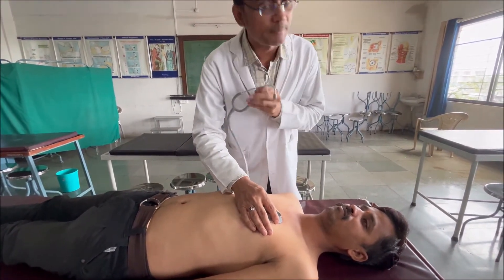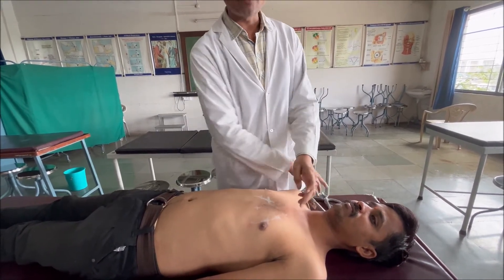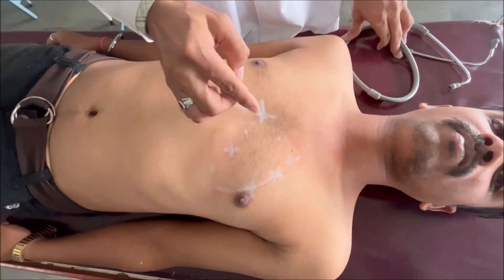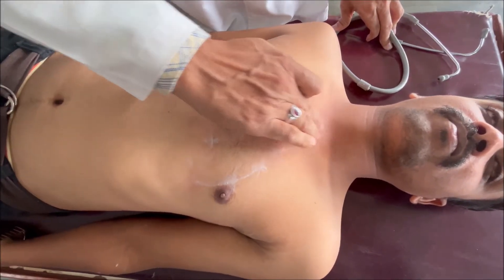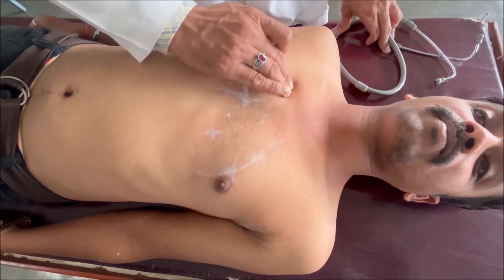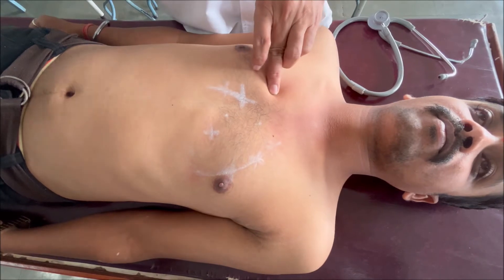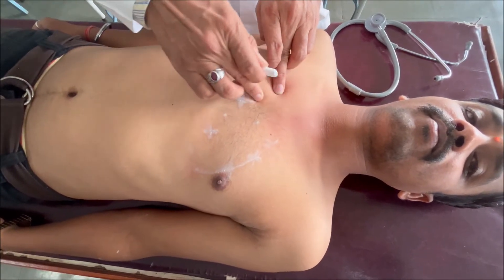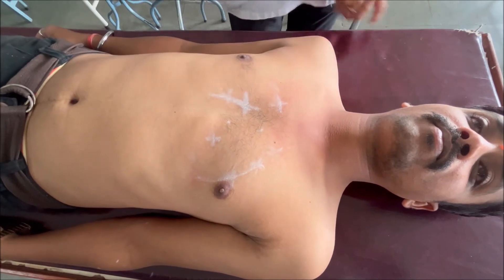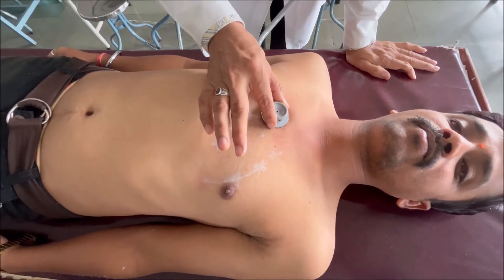Now coming to the aortic area. The aortic area is on the right side — the right second intercostal space near the right border of the sternum. From the sternal angle, identify the right second rib; just below it is the right second intercostal space at the right border of the sternum. Place the stethoscope directly over this area to listen for the heart sound.